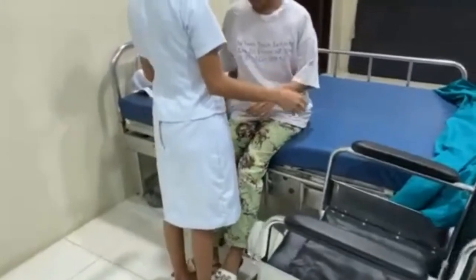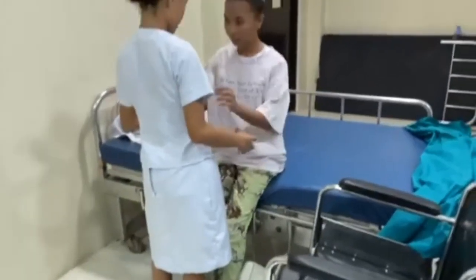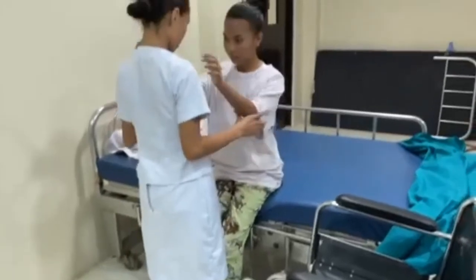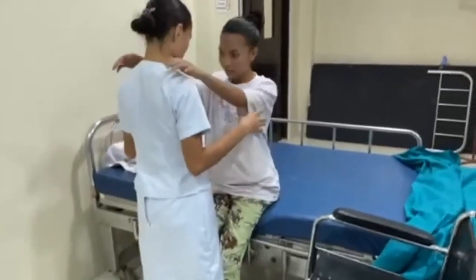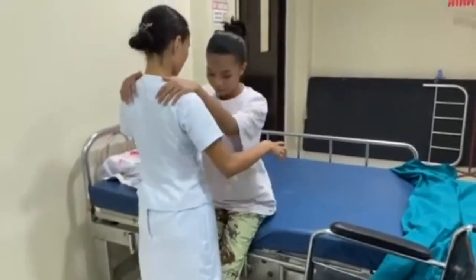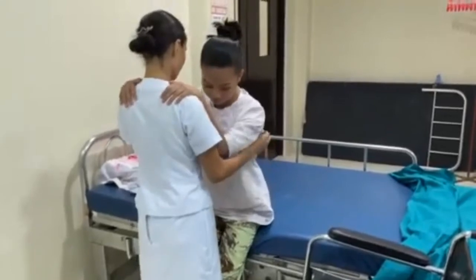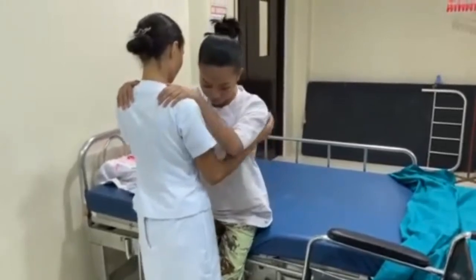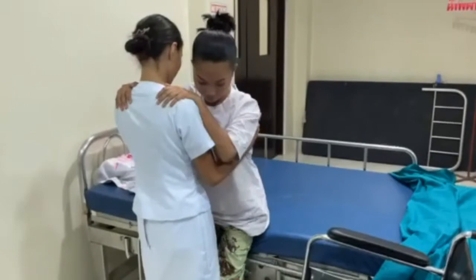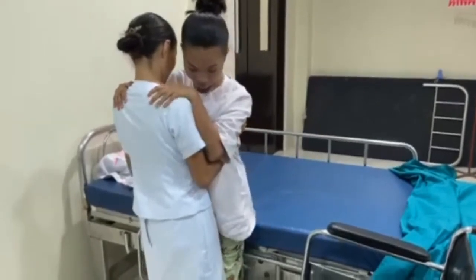Step 4. Position yourself correctly. Stand directly in front of the client and to the side requiring the most support. Hold the gait or transfer belt with the nearest hand. The other hand supports the back of the client's shoulder. Step 5. Assist the client to stand and then move together toward the wheelchair or sitting area to which you wish to transfer the client.